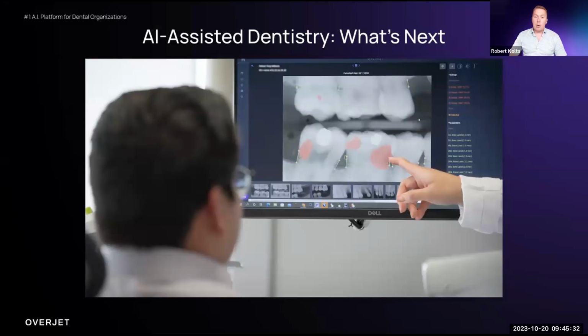I think right now you'll notice everything is 2 dimensions. So I don't think I actually showed a PA, but we've got bitewings, we've got PAs, we've got panoramic images, and that's really where the AI has been focused. But we recognize that 2-dimensional radiographs obviously have limitations, and they actually represent a relatively small, maybe 20 to 30%, of the information available in a patient's diagnostic experience. I mean, you have a whole patient sitting there in a chair that right now we don't have access to.